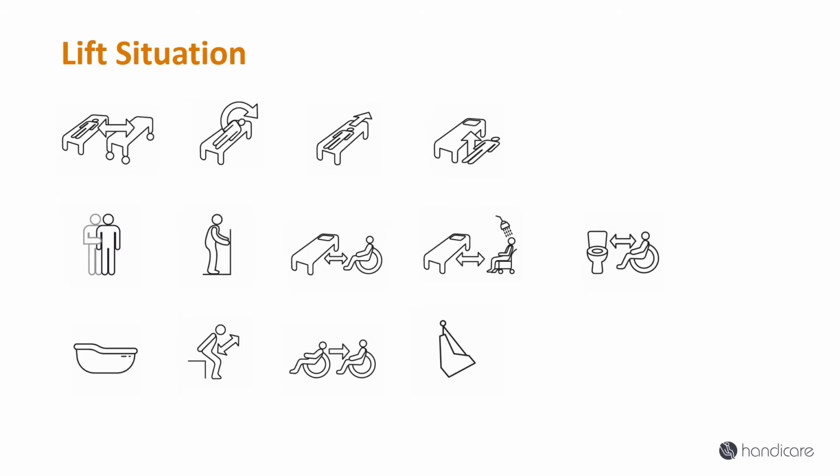What about a non-weight bearing resident who requires a transfer to the toilet or commode? At this point, the healthcare professional will determine which sling, for example, the Hygiene sling or the universal sling, is most appropriate and safest for the resident to use. And for the resident who requires assistance with repositioning or turning in bed, the healthcare professional will assess and determine if a positioning sling or a tri-turner sling would be beneficial for the resident and caregiver in this situation.